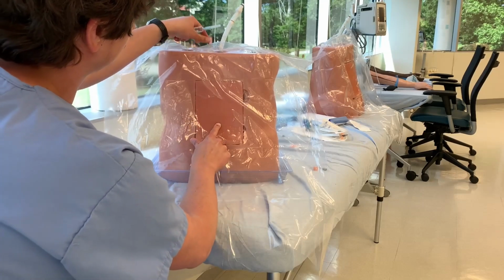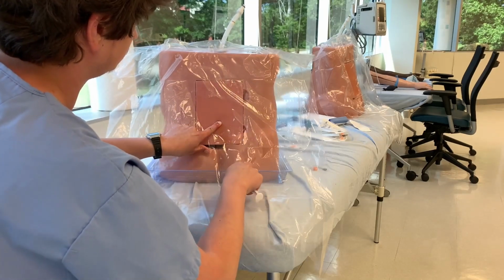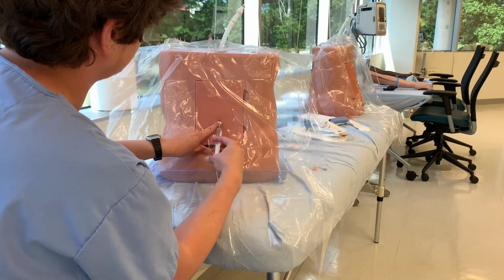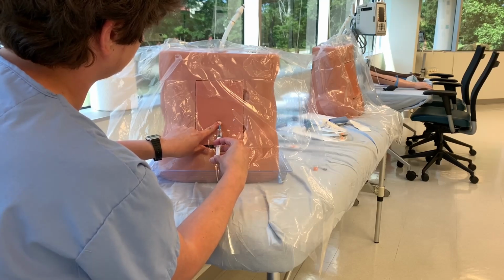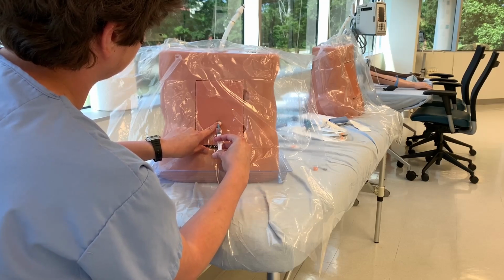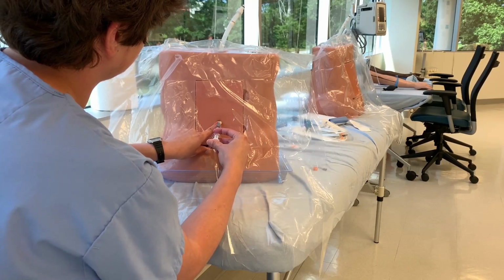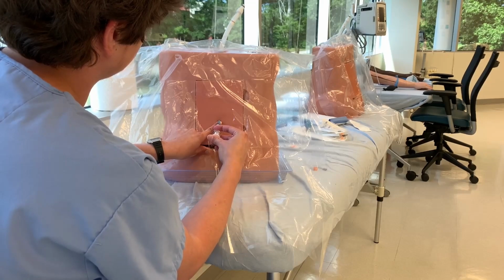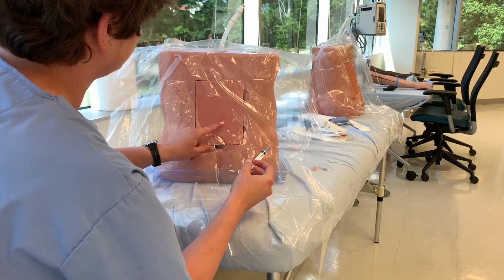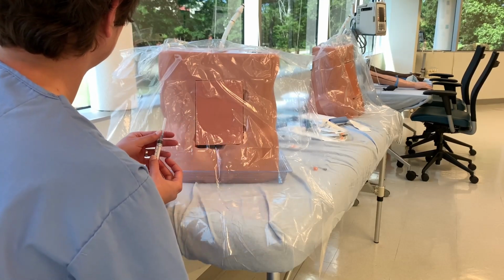So again, I'm feeling for the vertebra, specifically trying to find the space between them. Going to make a little lidocaine skin wheal, W-H-E-A-L. Just numbing up the area, waiting for it to set in, and then you can trace the path that you want to take with the lidocaine needle, numbing along the way to ensure you have a path of anesthetized skin and tissue. And then in a real patient, we'd wait for this to set up.